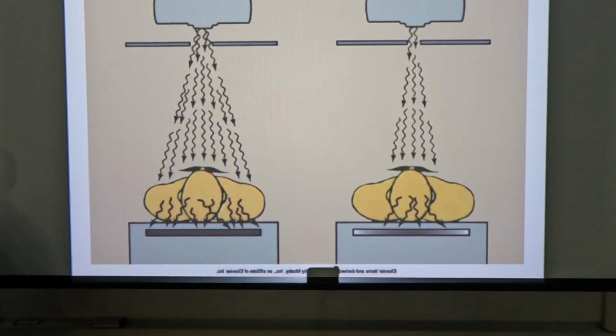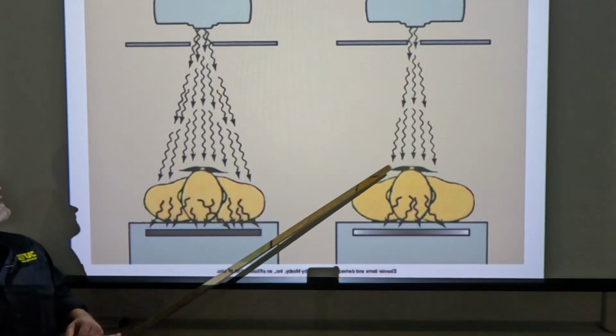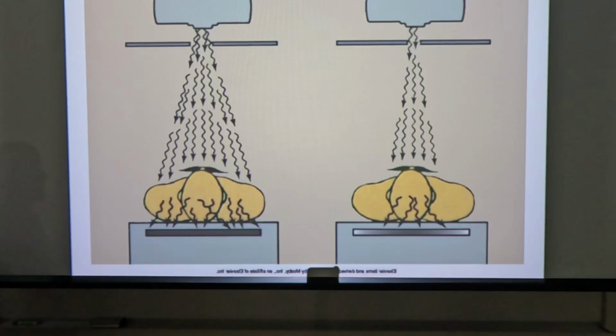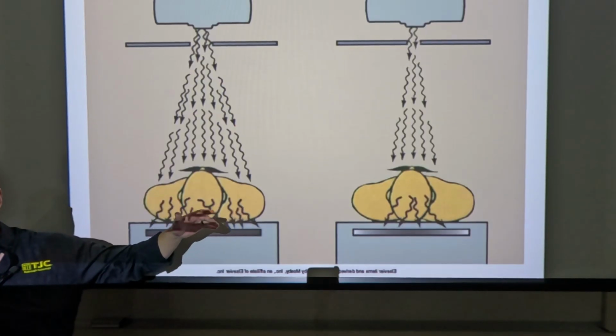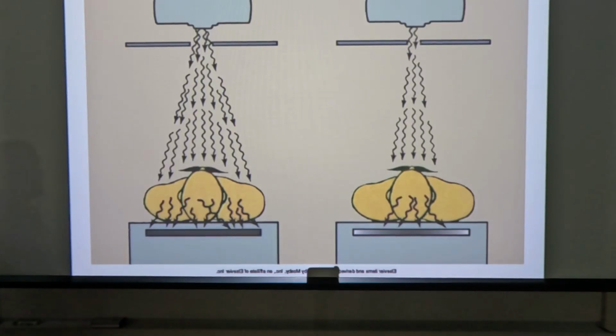So, we get to collimation. As we increase collimation, this is increased collimation over here, decreased collimation. As we increase collimation, we're going to limit the beam to what tissues we want to expose, right? So what was the original purpose for collimation? It's beam restriction. For what purpose? Radiation protection. Radiation dose, right. So it's radiation dose. The dentist did that, right?